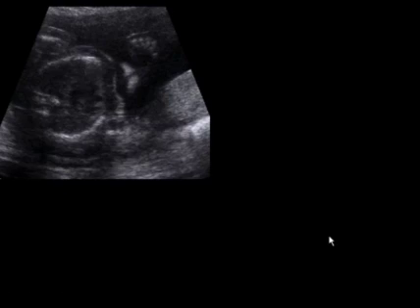Here's another patient who was brought to my attention because of the possibility of a cleft lip, and here's the upper lip right here. The rest of the face would be here, and there is a cleft or a vague cleft right in the midline, sort of obliquely there.